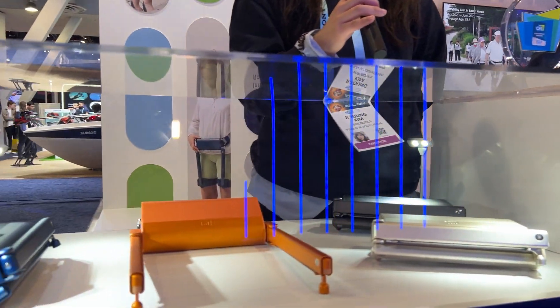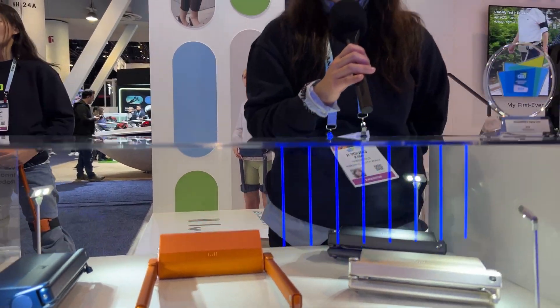WIM is a wearable robot to help your walking. We have two main modes. The first one is assist mode. In assist mode, it will lift your legs and push off the ground, so you can save your energy by 20%.